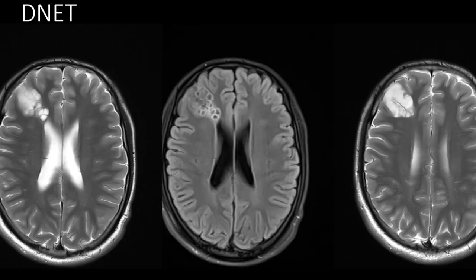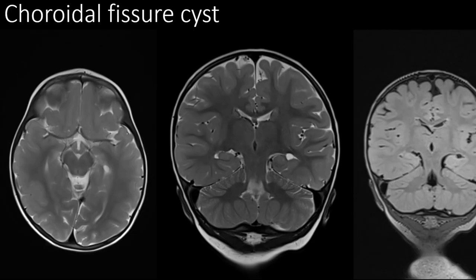Now coming to a few mimics of perivascular spaces. This is a case of DNET or disembryoplastic neuroepithelial tumor. This case shows a cortical-based lesion in the right frontal lobe which appears heterogeneously hyperintense on T2. There is partial suppression of the T2 hyperintense signal on FLAIR — note the evidence of gyral thickening. A choroidal fissure cyst can be made out by its characteristic location: a cystic lesion in the region of the left choroidal fissure abutting the left hippocampus, appearing hyperintense on T2 and suppressing completely on FLAIR, with no mass effect or perifocal edema.